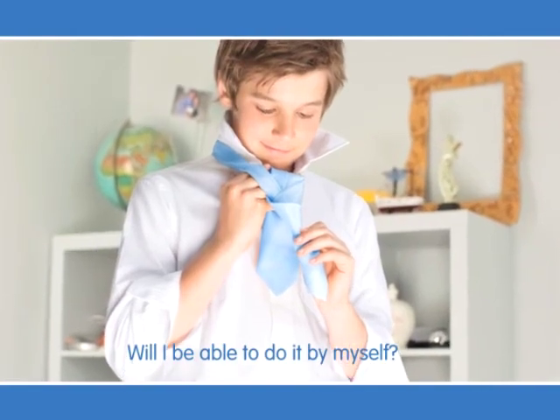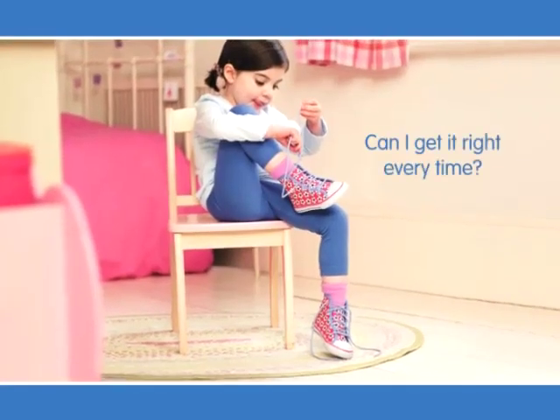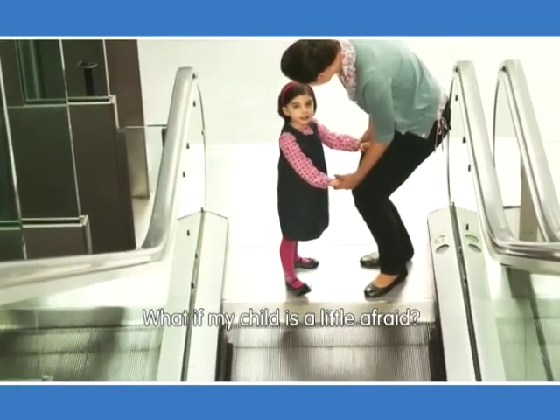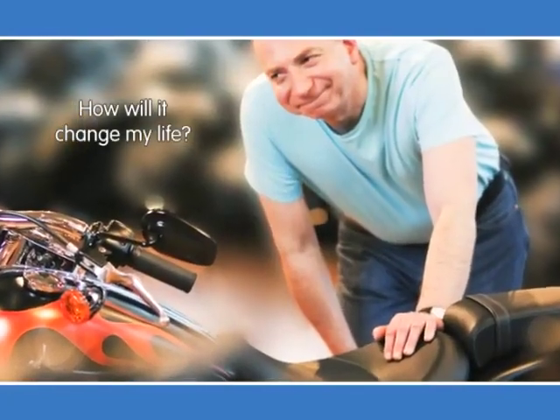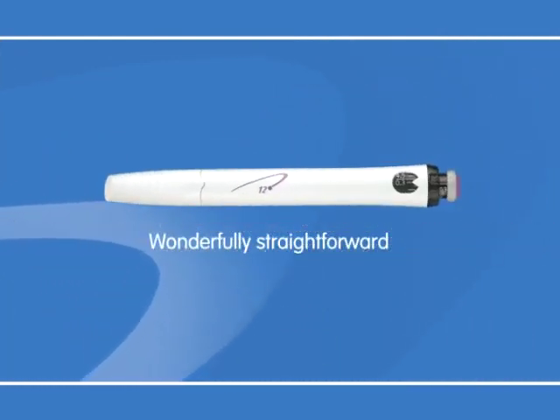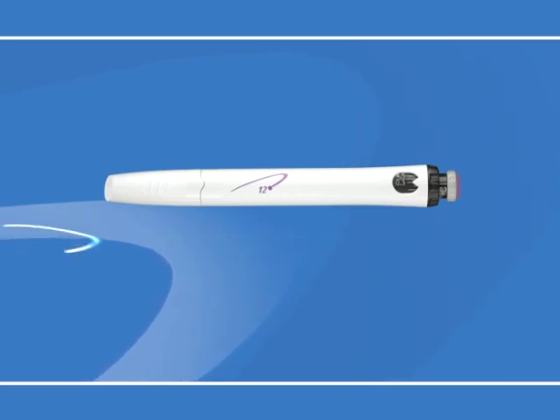Will I be able to do it by myself? Can I get it right every time? What if my child is a little afraid? How will it change my life? Questions like these from patients just like you helped us create the wonderfully straightforward Go Quick Pen. For example, Go Quick is pre-filled, so you use it until empty and then just start a new one.